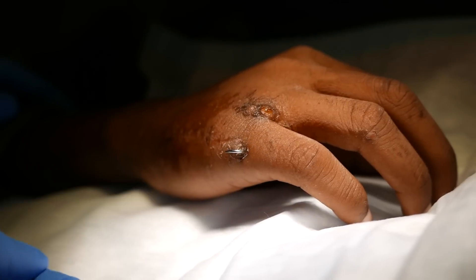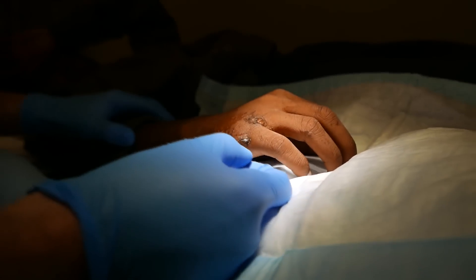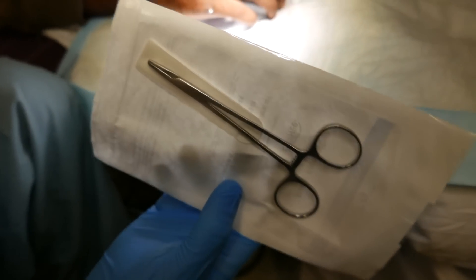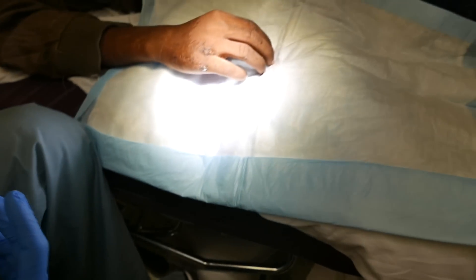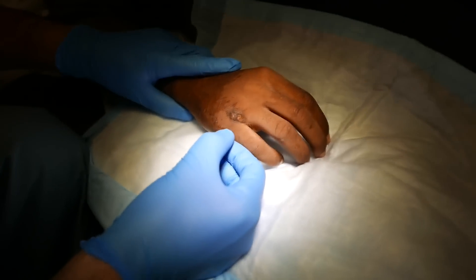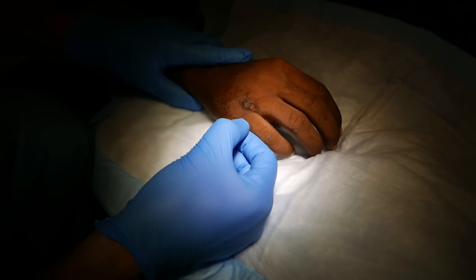We're first going to try to pull this out manually with traction — applying force along the vector of the pin. If that doesn't work, we have some gripping needle drivers here that we can apply to the pin to give us more force. Here we go — are you ready?